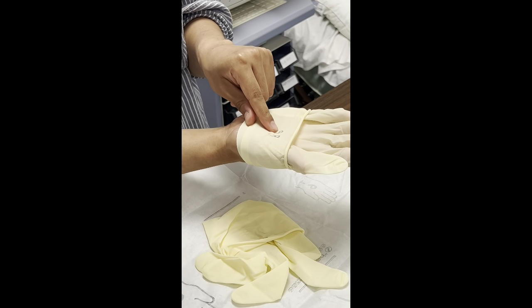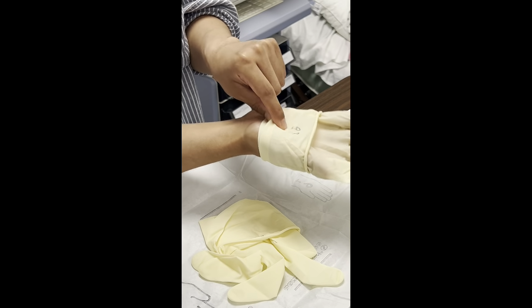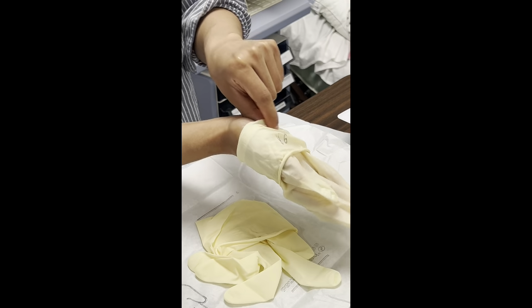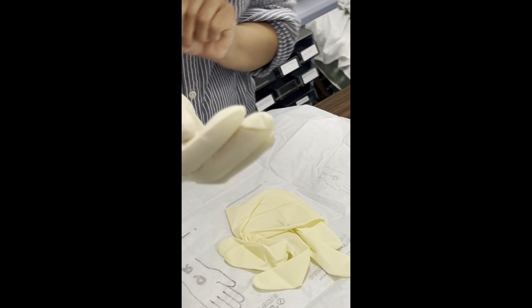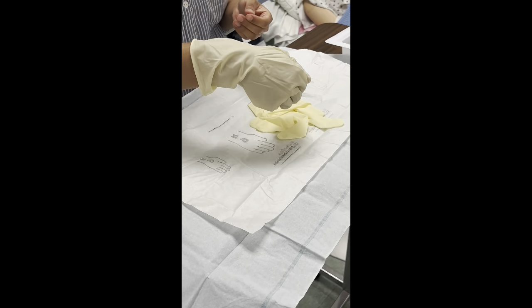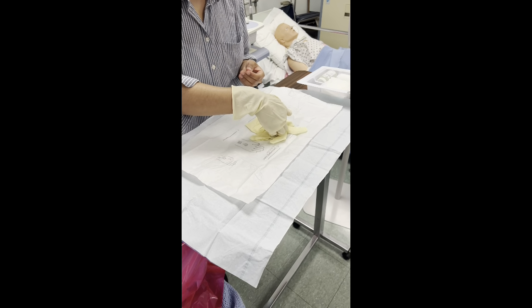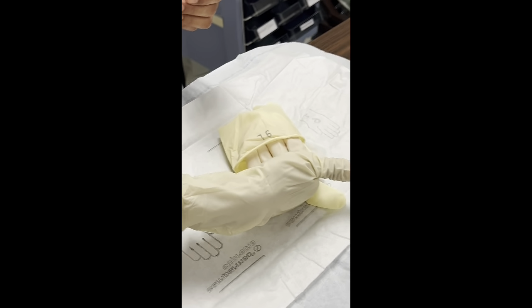So as you open your package of the sterile gloves, it's okay to hold and touch the inside of the glove. Okay, so as I pull down. Now, applying the glove on the other hand. You're going to take your sterile glove here and go under the cuff.